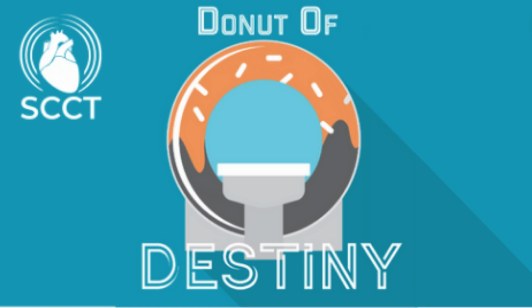Excellent. I think this leads nicely into talking about why do systolic imaging. Could you briefly describe some of the advantages of systolic imaging over traditional diastolic imaging? Yeah. The most obvious advantage is no need for beta blockers, because you're no longer trying to maximize that diastasis.